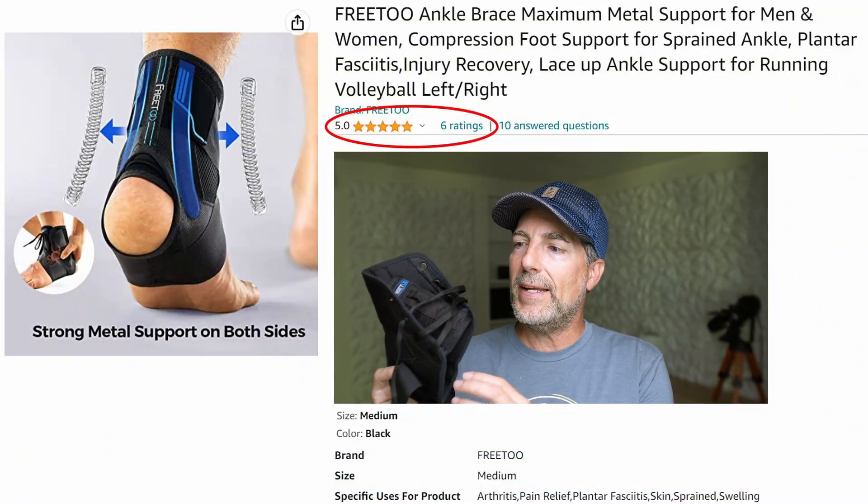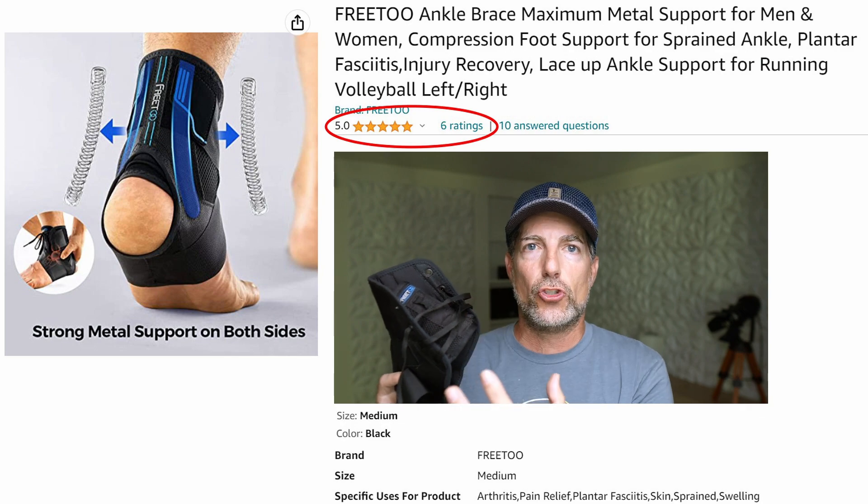Quick review of the Free 2 Ankle Brace. This is a lace and strap compression ankle brace designed for left and right feet. It does come with a user's manual that will help guide you through how to wrap it or put it on your ankle.